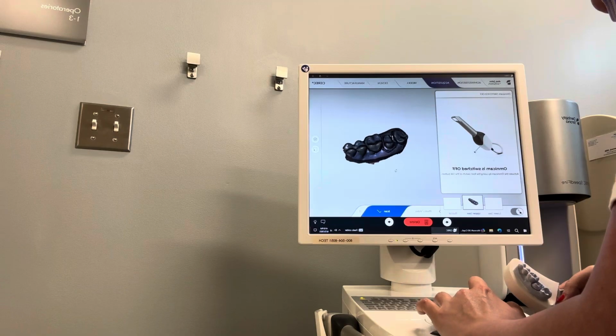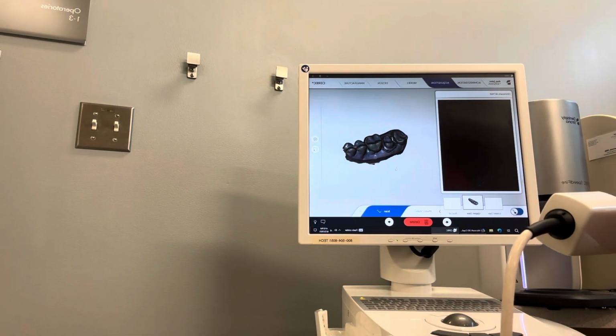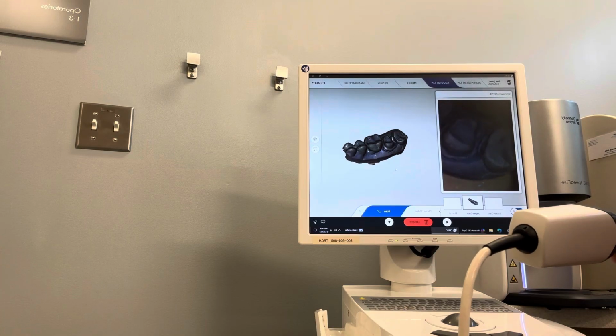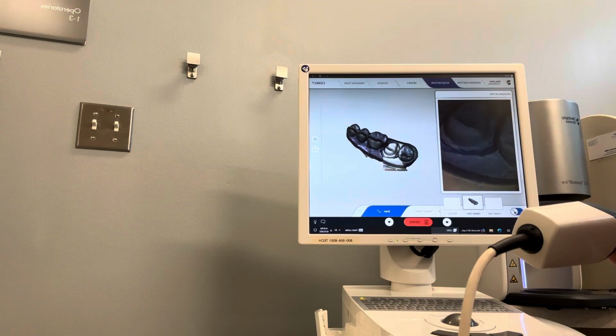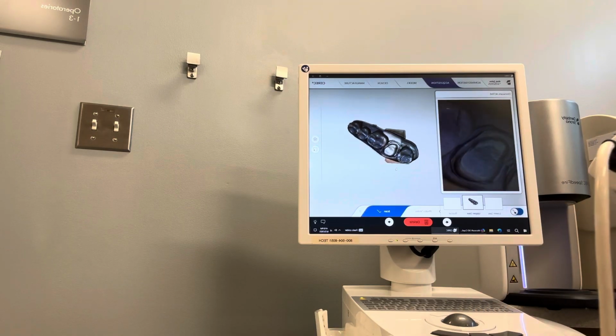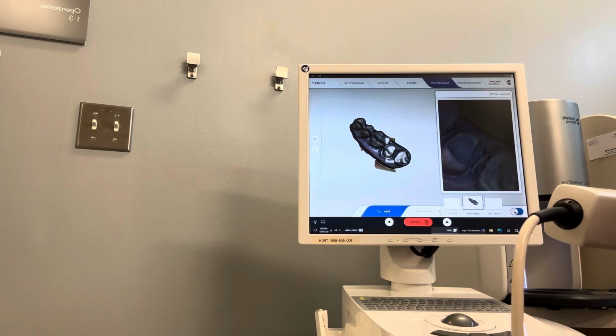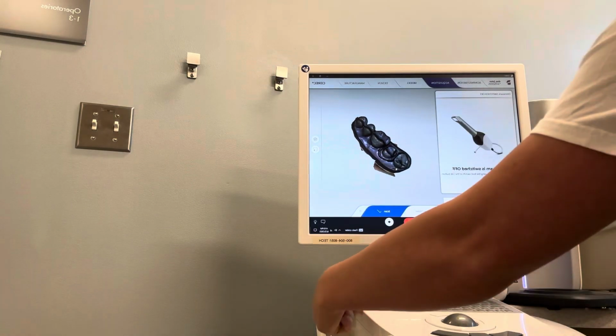I'm analyzing this. I think I go back in to fix a contact area. I don't know how to cut videos in this app, or I would.